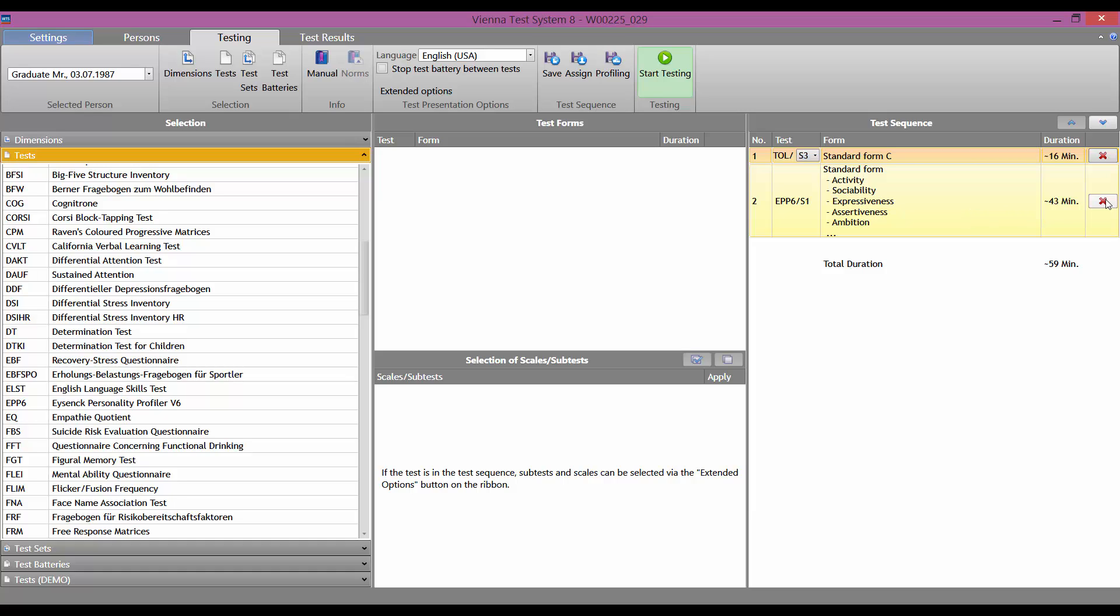If you are satisfied with the selection, click on Start Testing in the menu to present the test.